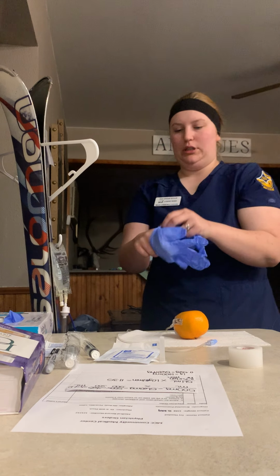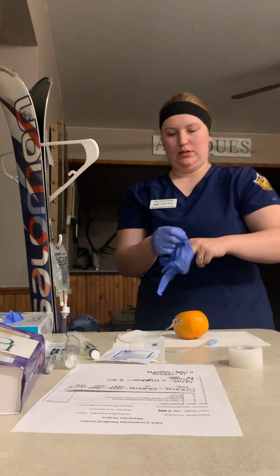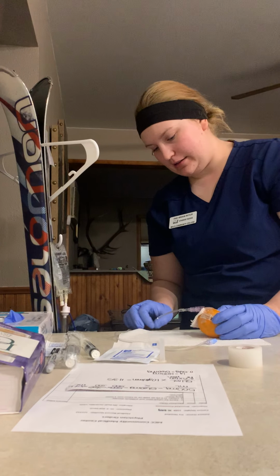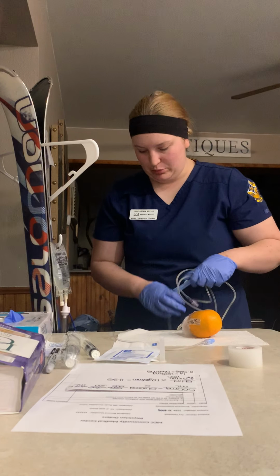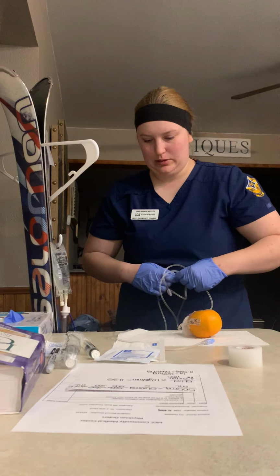Put on some new gloves. And while you're here too, make sure you're just assessing that IV site, making sure your fluids are running. And we're going to adjust the primary roller clamp.